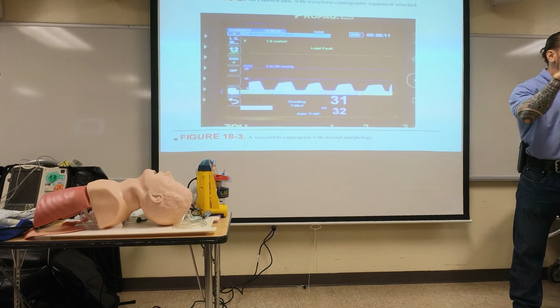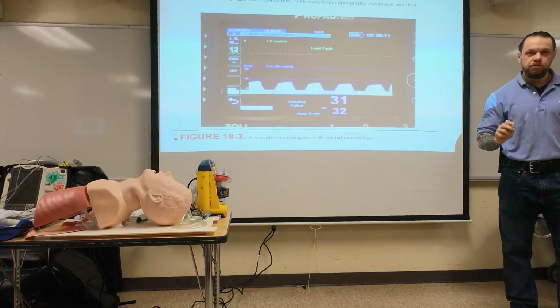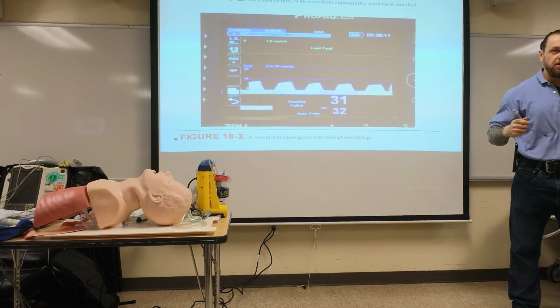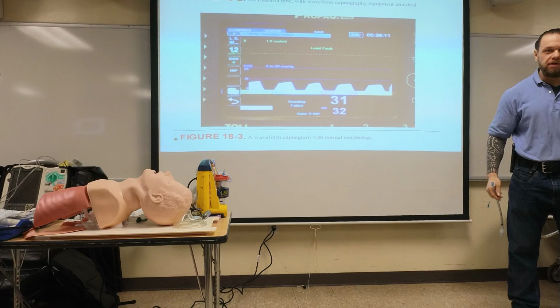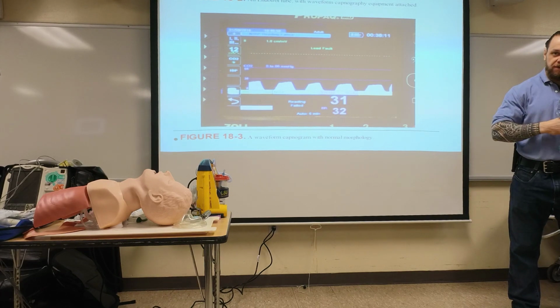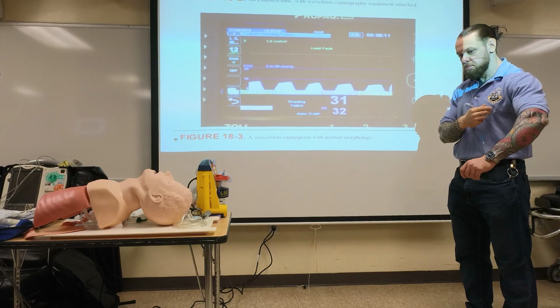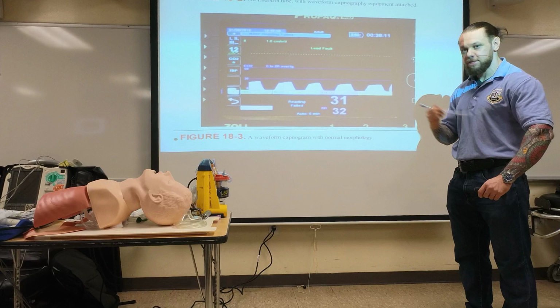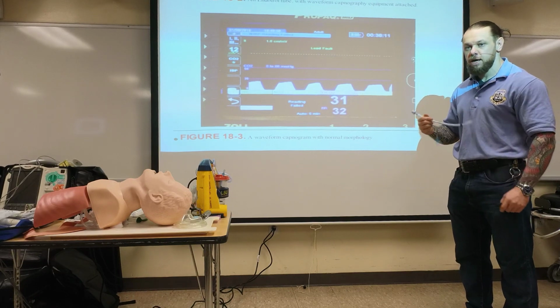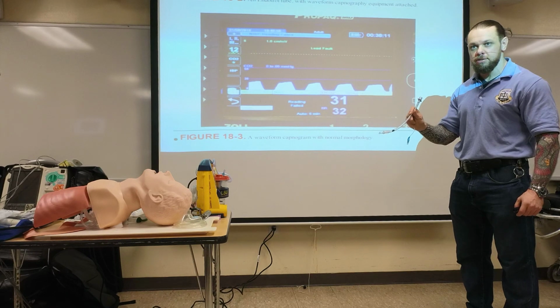What happens if you go too far down? You're going to be where? Right, right mainstem. Very good. So the reason you do lung sounds is not to listen if they're wheezing or whatever. I listen on each side, left and right, at my mid-axillary line, on both sides, not anterior, because I want to hear left and right. If I put it too far down, I'm going to only have the right side.